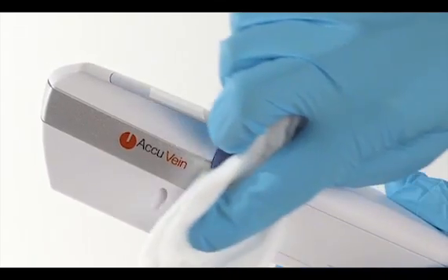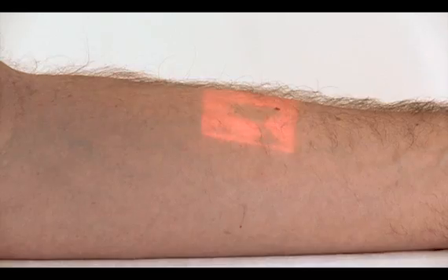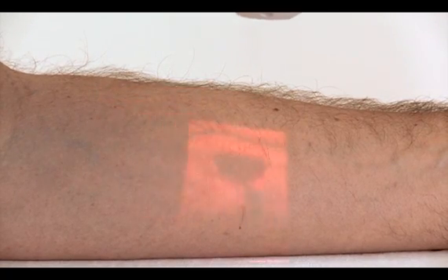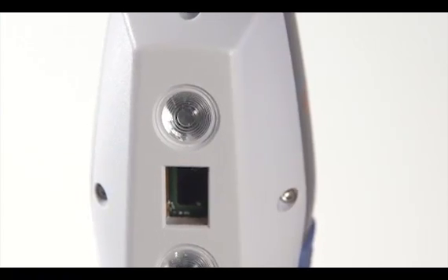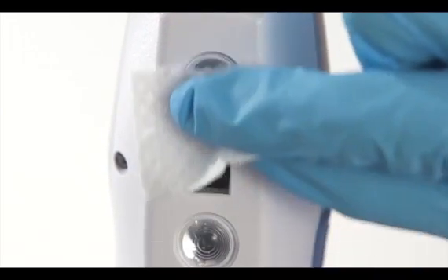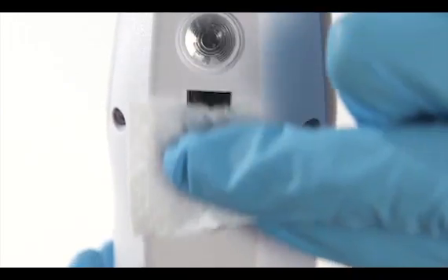The AccuVein AV400 is made of medical grade plastic. Clean the body of the device and the charging cradle with any hospital approved wipe. If you see spots on the projected sight, this means you have to clean the vein viewing lens. You can clean the lens with a slightly damp, pre-moistened alcohol prep pad. Too much liquid on the cloth can damage the AV400.